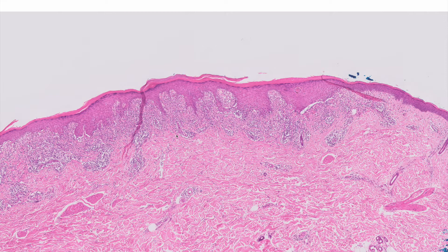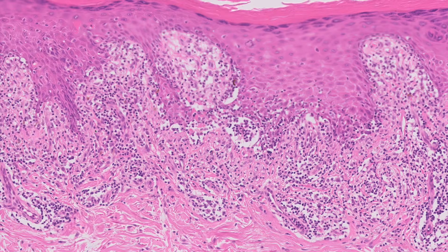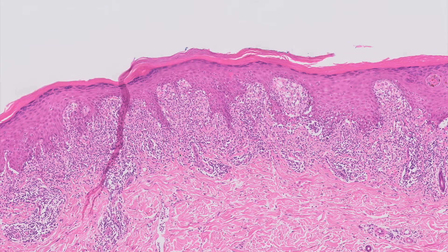The most important thing not to miss when diagnosing these is a melanocytic lesion, and most importantly a melanoma with a brisk lichenoid inflammatory reaction. It is very important to be satisfied that there is no obvious melanocytic lesion hiding amongst the inflammatory reaction, which can sometimes be quite difficult. In this example, where you have nesting in groups of inflammatory cells at the base of the epidermis, you may question whether there could be a melanocytic proliferation, and I have a low threshold for performing immunohistochemistry for melanocytic markers just to be sure.